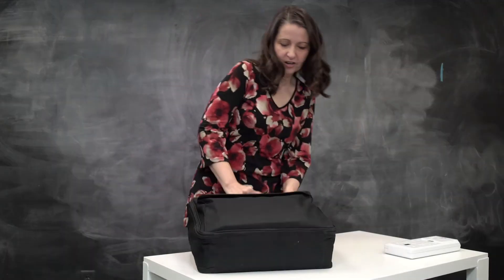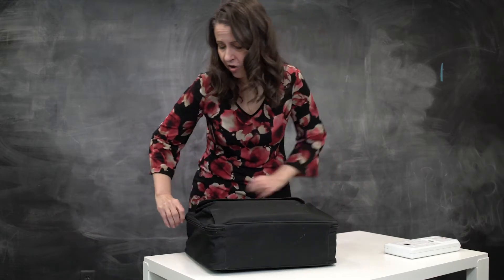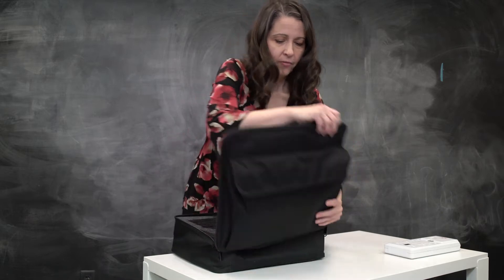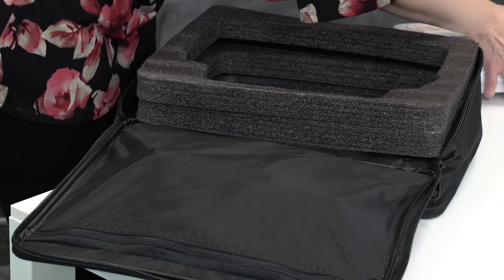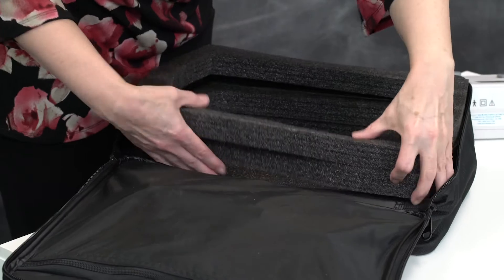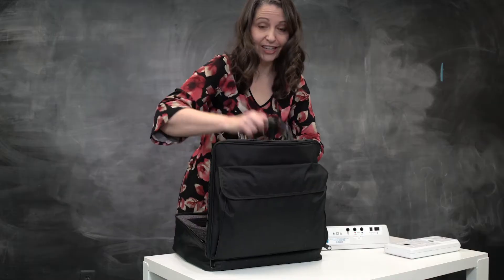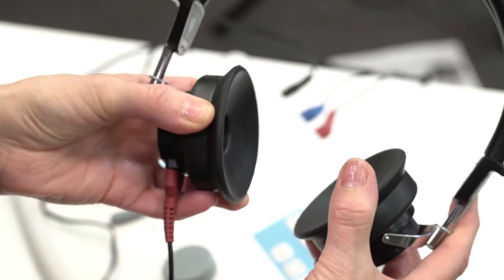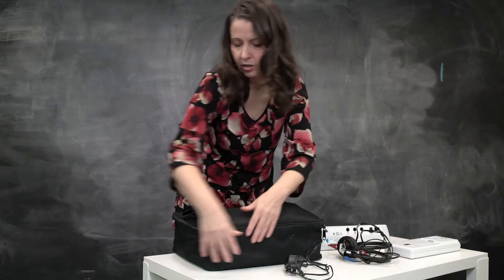Setting up for school screening. We're getting out the audiometer. Make sure it's a nice quiet room. And try not to keep it in a cold place at night — in other words, don't leave it in your car. We have the headphones and we have the power cord.